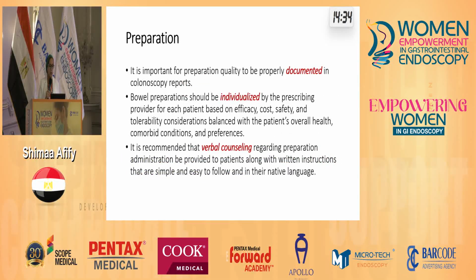It is very important that the bowel preparation be documented in the colonoscopy report, because this will reflect how good your examination of this colon was. So it should be documented. Various scores exist to document with.